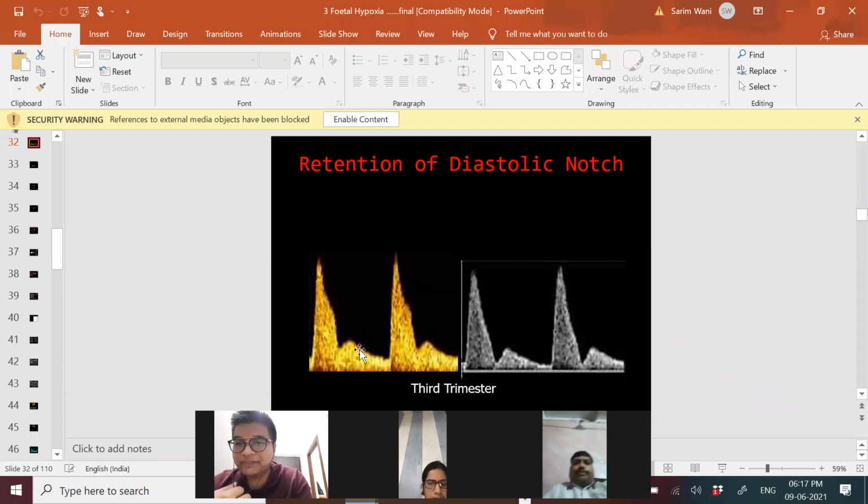Okay, remember this 5. Very good, 10 upon 2 is 5. Now, due to any reason, if this is not 2, this is 1, so 10 upon 1 will be how much? S by D ratio? 10.